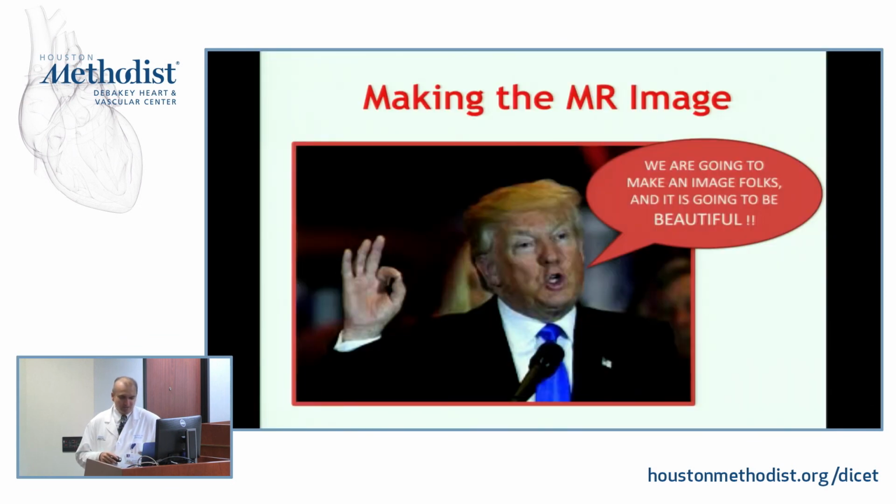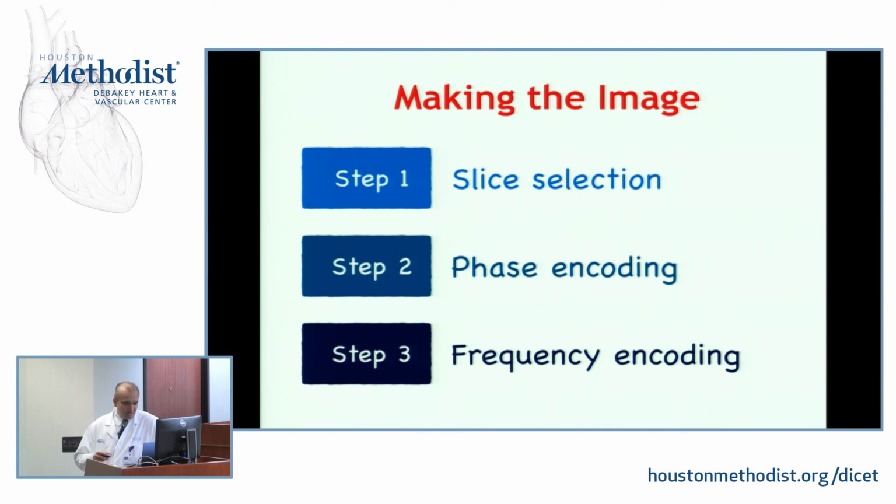So next step is let's talk about how we're going to actually make an MRI image, okay? And the goal obviously is to make very high quality, attractive images. And MRI has the ability to do that as long as you know how to manipulate the scanner. So a few things that we're going to utilize.